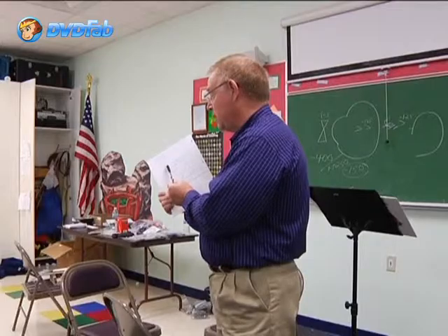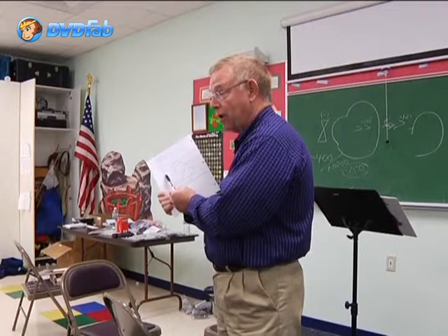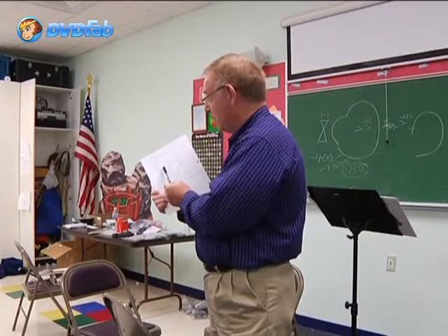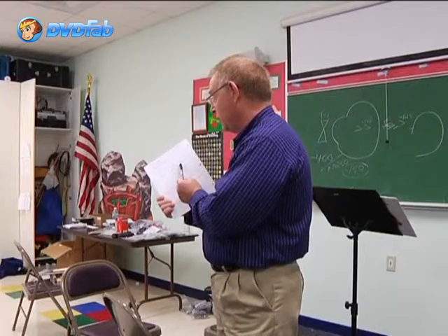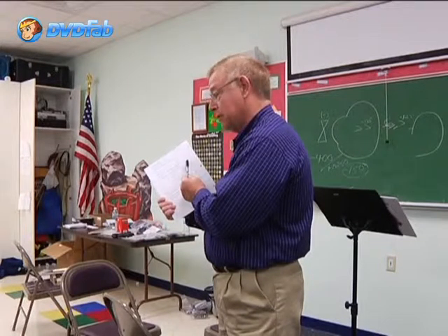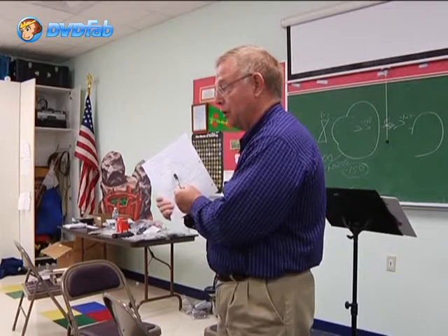Compare the minus 0.50 and the minus 1.25. If he chooses the minus 0.50, no glasses are needed, right? If he chooses minus 1.25, compare the 1.25 and the 1.75. If he chooses minus 1.25, you are done.